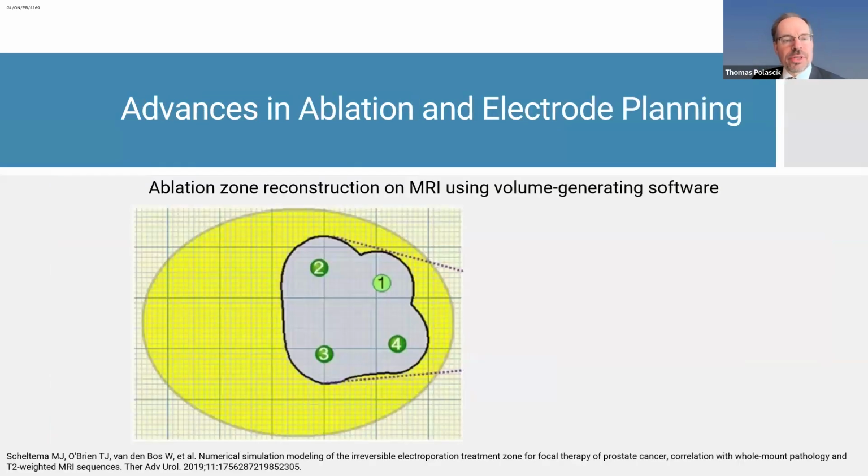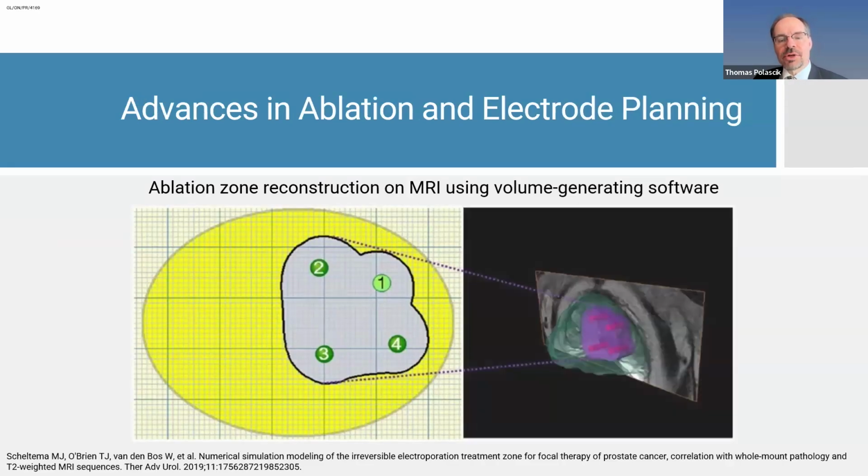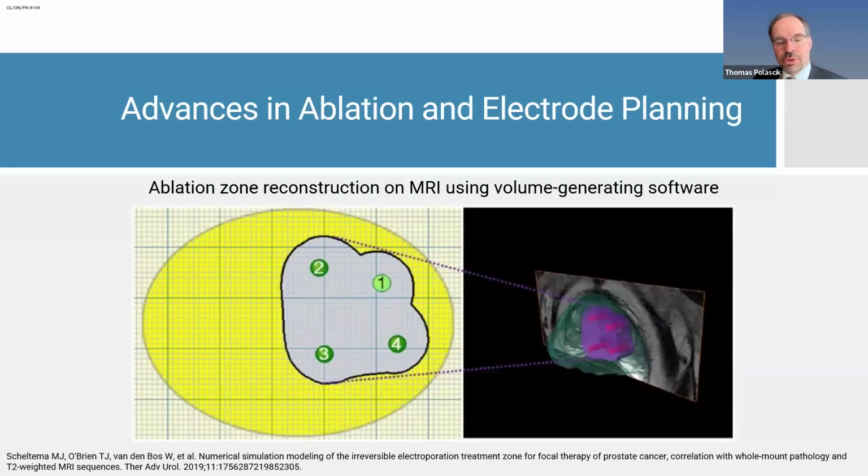And there's a lot you can do with this, not only with treatment, but you can then reconstruct on MRI with software. And you can save these images. You can save pre-treatment, post-treatment images, etc.